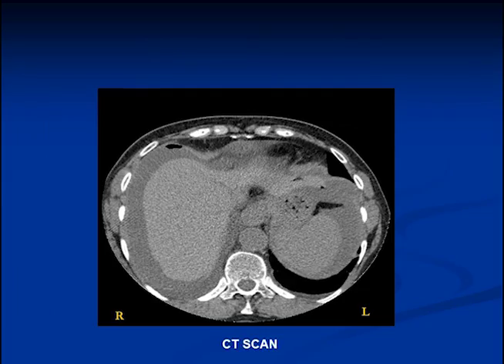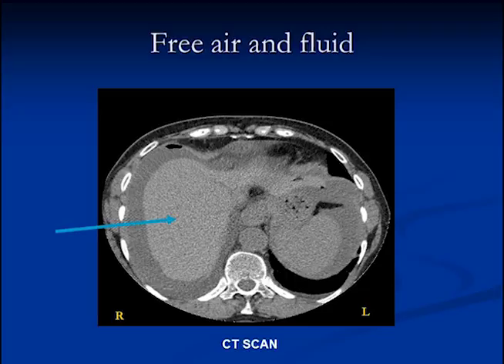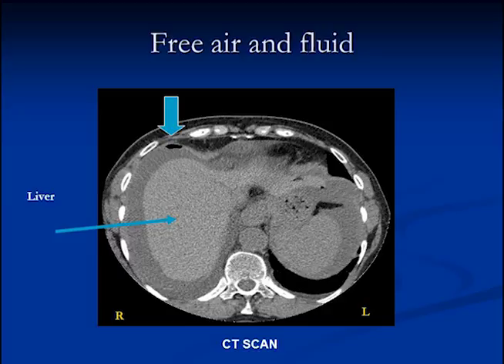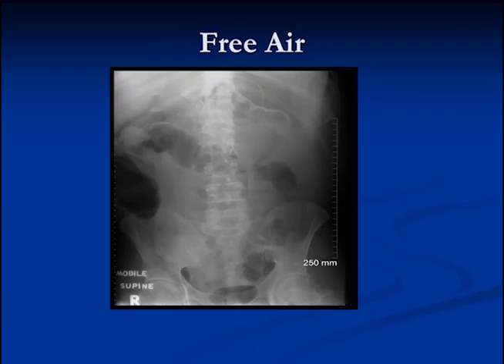On CT scan, we can see very small quantities of free air. Here we see the liver, and we see fluid and a tiny bit of air present — that's all you need to tell you there is a perforation somewhere in the gut, and then you look further to find out where it is. One of the important things we do is try to recognize free air on a supine plain film, which can be very difficult. We need that dependent view — upright or decubitus — it really is an important view, but sometimes the patient is so sick that we can't get those dependent views.